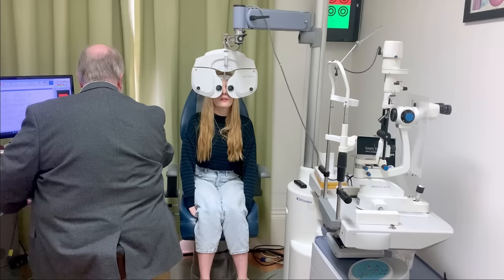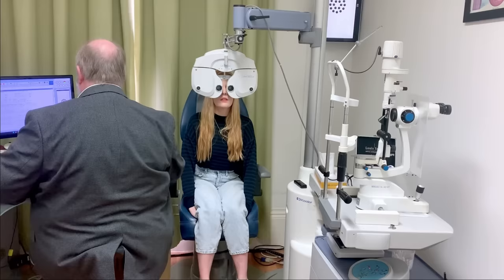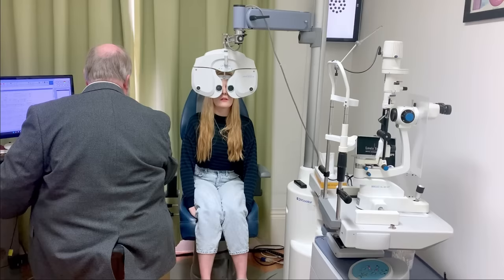So, I'm going to change to a set of dots. Let me move to my dots. There you go. Can you see my dots there? Yeah. I'm going to place two lenses, one and two. I'd like you to tell me which one makes the dots any clearer for you, okay? Okay. So, that's number one. Or is it better with number two? I think two is okay. Better. Do it again. That's one. And that's two. Oh. Or is there not much? They're not that much different. They're pretty similar? Yeah.